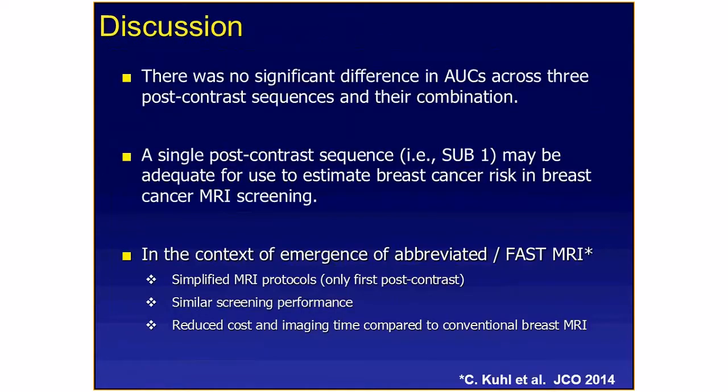As a background for why we are doing this: breast MRIs, people can say, MRI is very expensive and takes a longer time to get. For screening, it may not be the best one. It's a few thousand dollars in expense.